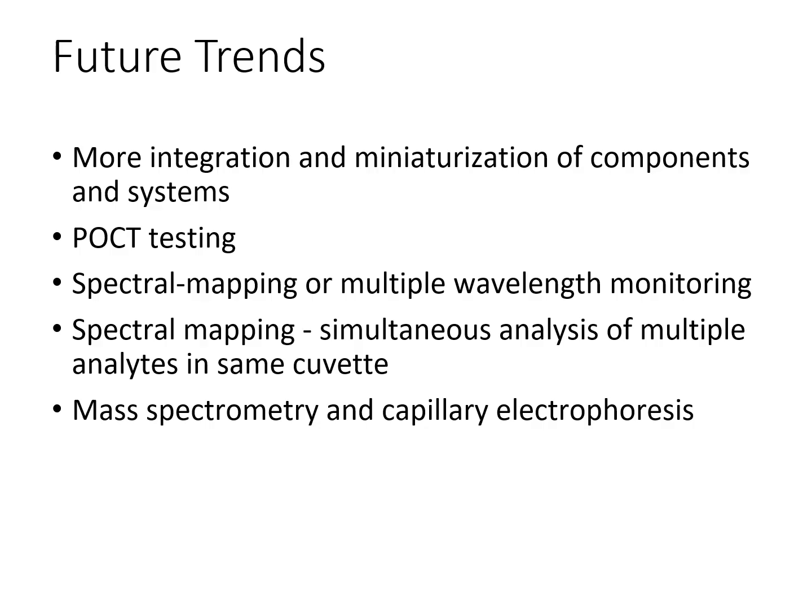So some significance of this, these advancements kind of help to revolutionize, if you will, diagnostic laboratories by improving speed, accuracy, and versatility. The miniaturization and integration make testing more accessible and convenient, especially in decentralized settings. And advanced analytical methods have helped open up new possibilities for disease diagnosis and monitoring at a molecular level.